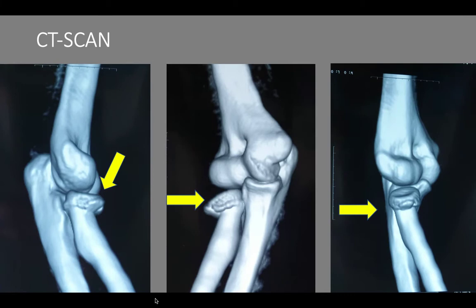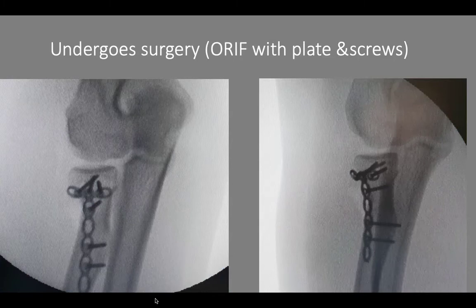She presented to us three days after the injury. This is a fracture where the radial head can be saved and we can get excellent results. She undergoes surgery, which is open reduction internal fixation of the radial head with plate and screws.